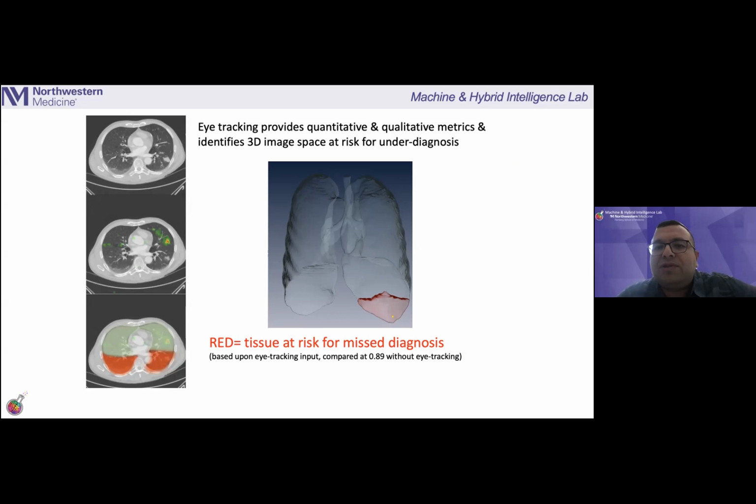In our initial work, we were retraining the whole system. Currently, we are searching for how we can do this with an active learning algorithm without retraining the whole system, but just updating the model per case.